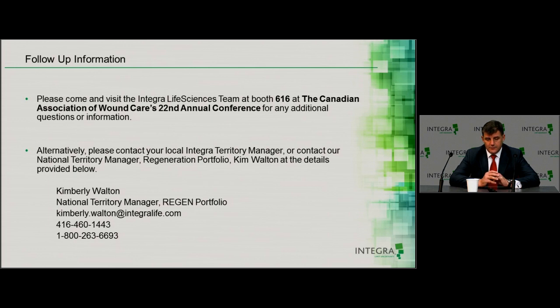But negative pressure wound therapy, one other place is in massive wounds that are very badly colonized. You can use negative pressure wound therapy with instillation for 1 week's time. That's an inpatient therapy. We do a debridement, 1 week of negative pressure with instillation, and then we put our IDRT therapy on at the end of a 1 week period with an additional 4 days of negative pressure wound therapy. So they're in-house for 11 days. So there's a couple different ways of using it.